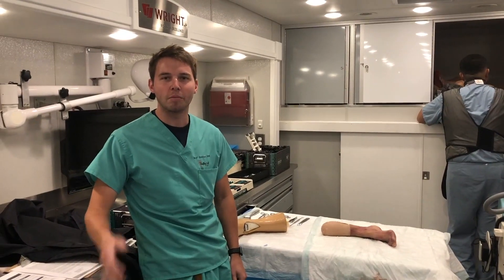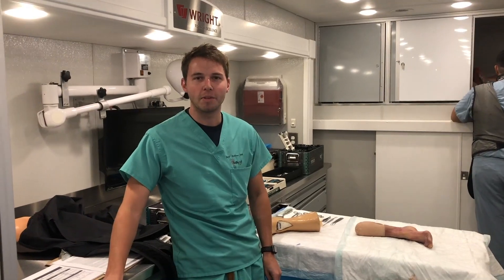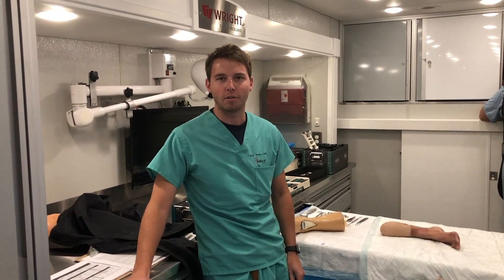Brett Brennan here with Healthy Feet Podiatry. Today I'm going to be doing a quick video and show you how the total ankle replacement can improve the range of motion in your ankle and decrease the pain in an arthritic ankle.